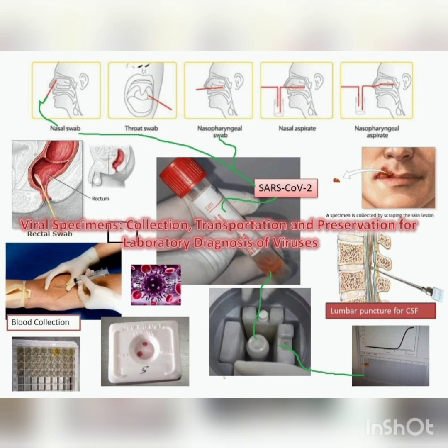So you need to avoid contamination with the normal flora. Normal flora means the bacteria which are normally present on your skin, on your body, around the mouth, or inside the mouth. Likewise, whatever specimen you are collecting, you should not touch it with the normal flora of the body, and avoid contact with oxygen. You should not allow the specimen to come in contact with oxygen.